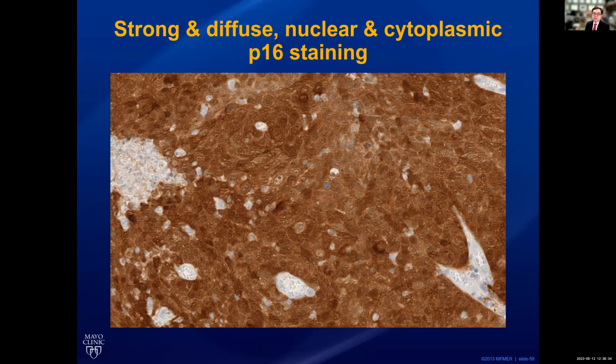published in 2018, and that's 5 years ago. The guideline is that above 70% P16 positivity, both nuclear and cytoplasmic stain, will be considered as positive stain. And remember, only oropharyngeal carcinoma has this prognostic value.